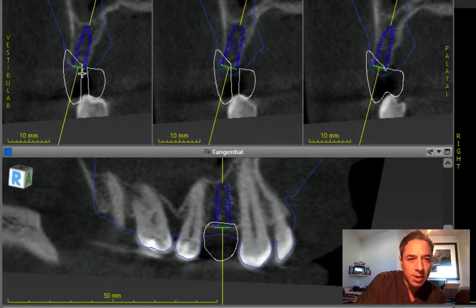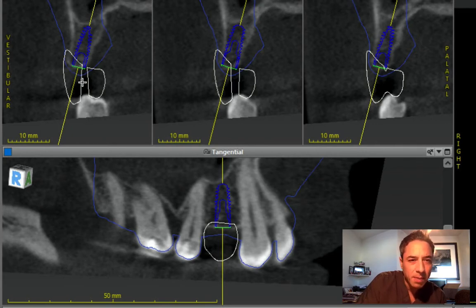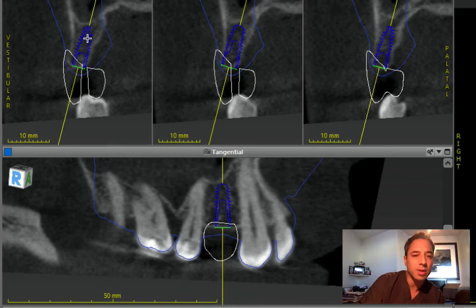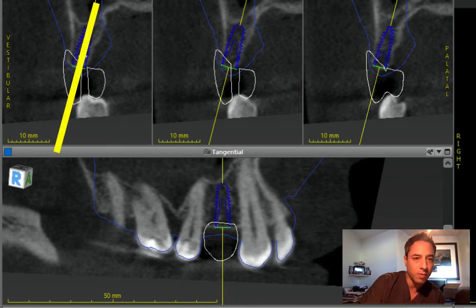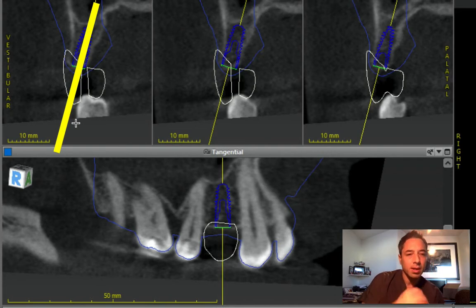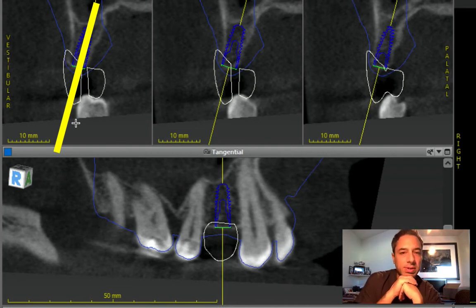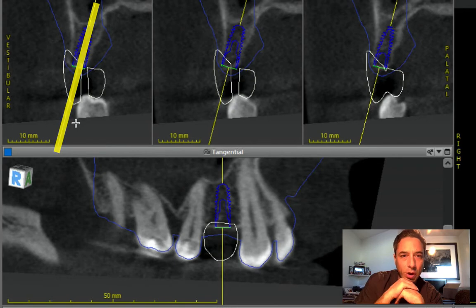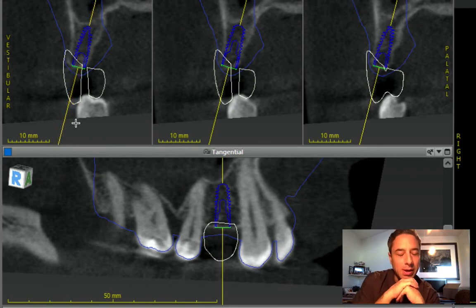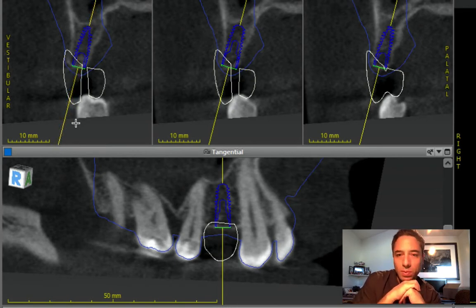the ridge is relatively intact in terms of the cortical plate. But you can see that this position is not for screw access — it is more for cementable. The question is, can this be improved? And in my opinion, no, this is the ridge that you can work with.